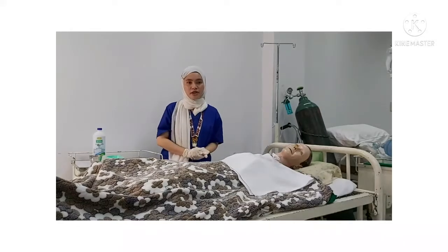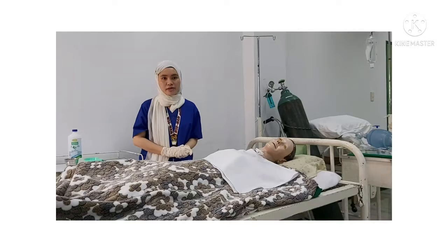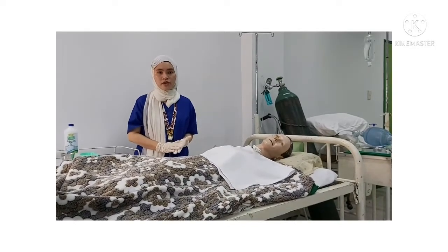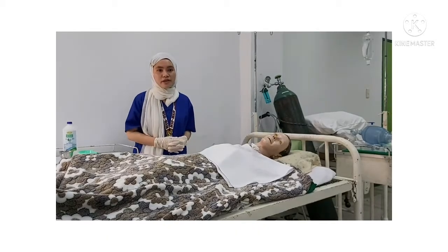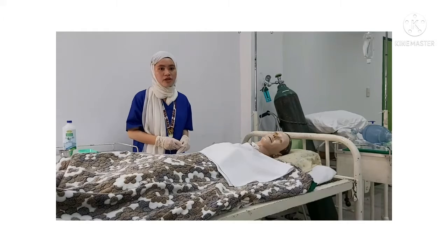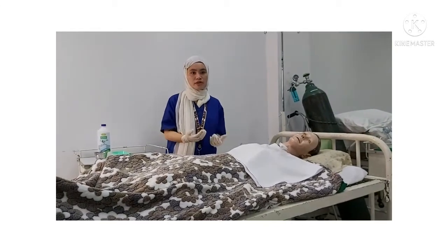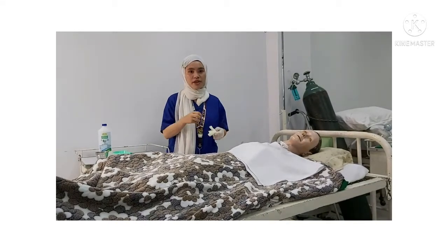Repeat suctioning as needed or according to the patient's tolerance. Allow 2 to 3 minutes of rest in between suctions to provide an opportunity for reoxygenation of the lungs. When suctioning is completed, turn off the suction machine, detach the catheter from the suction tube, remove gloves, and dispose of them safely and properly.